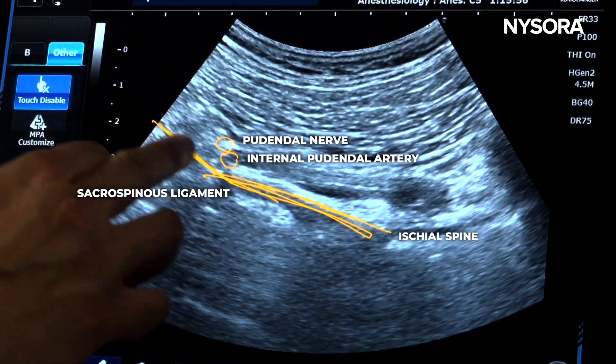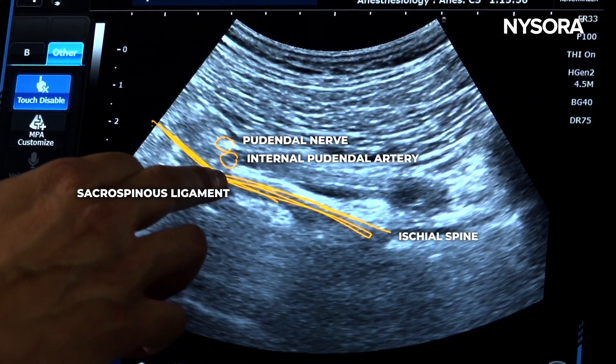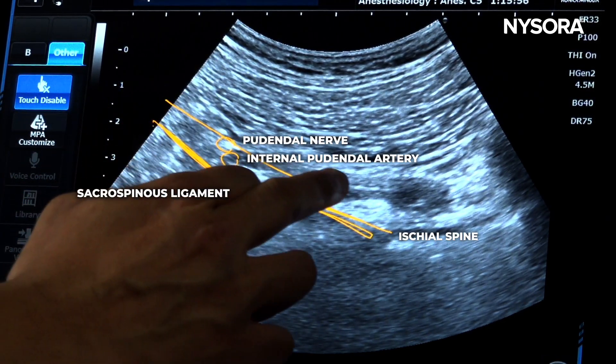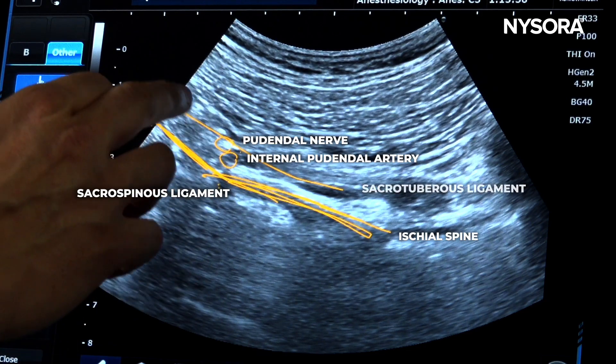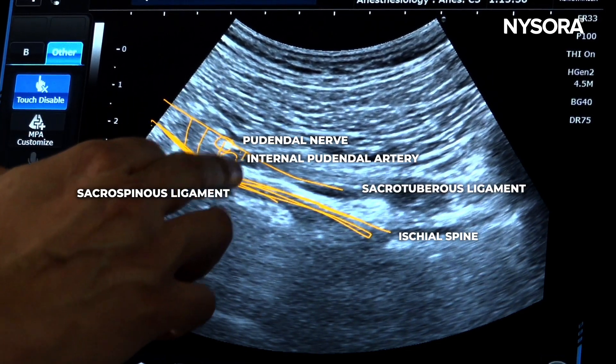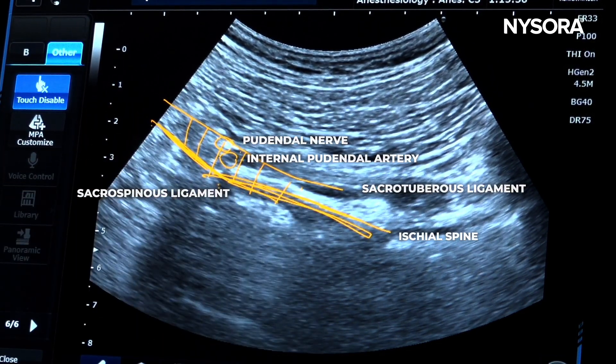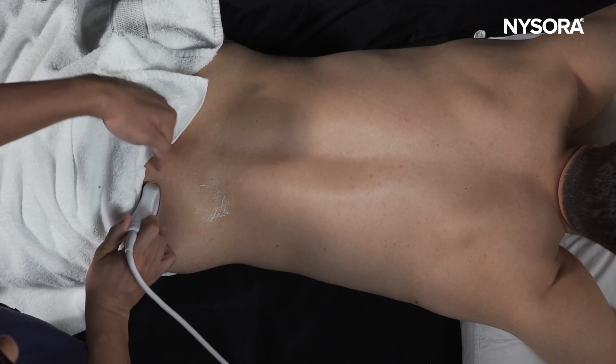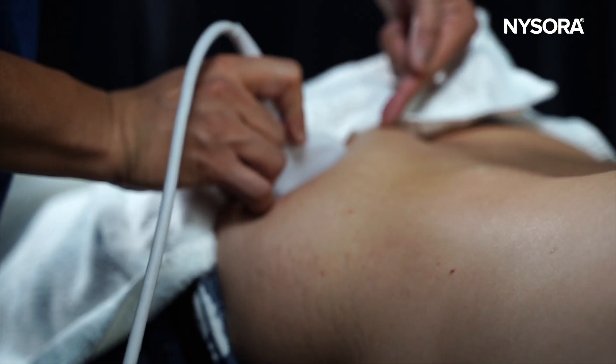The ligament between the sacrum and the ischial spine is the sacrospinous ligament. The ligament on top, below the gluteus maximus muscle, is the sacrotuberous ligament. Between these two ligaments is the plane — the target — for the pudendal nerve injection. The injection can be performed out-of-plane or in-plane.